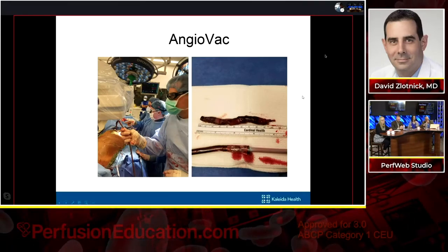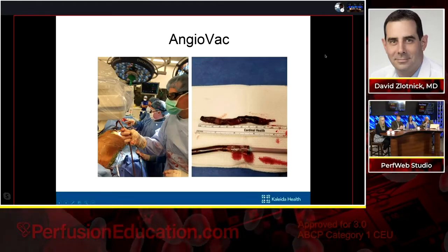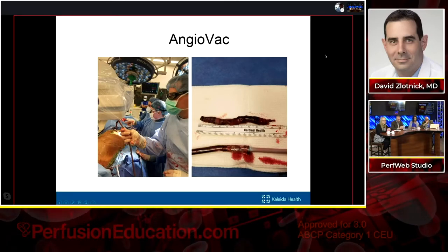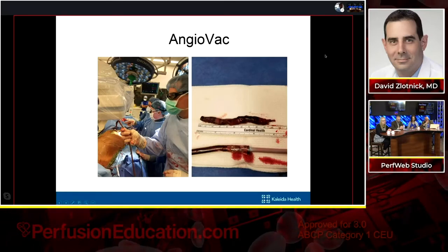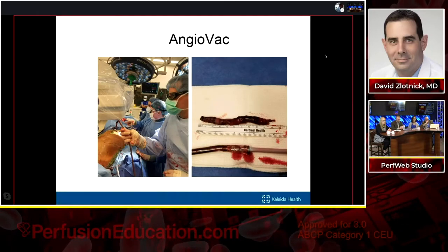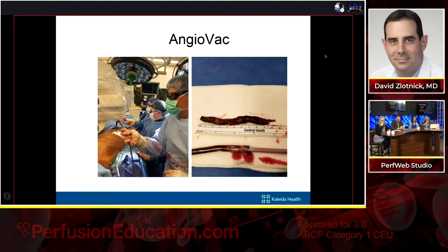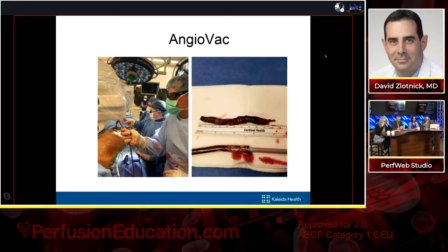Okay, perfect. So what you can see here is we're in the hybrid operating room, and we did an AngioVac to get rid of this clot. And one of the things that we wanted to discuss here in this case was that this patient has a tumbling thrombus in the right atrium. We presume that he also had concomitant pulmonary emboli with biventricular dysfunction.